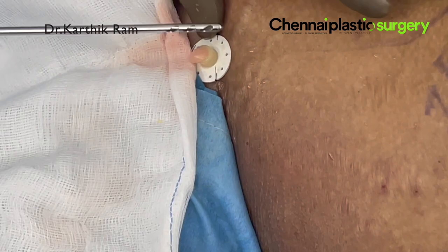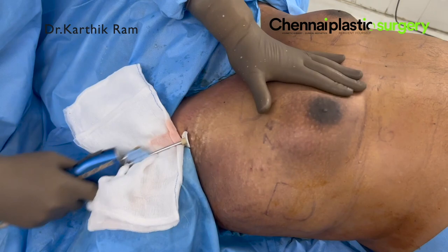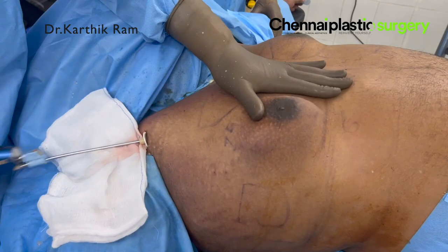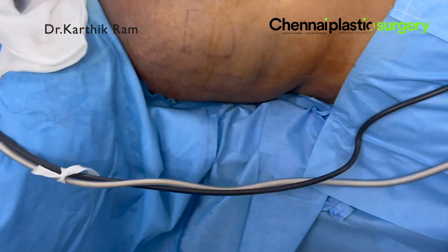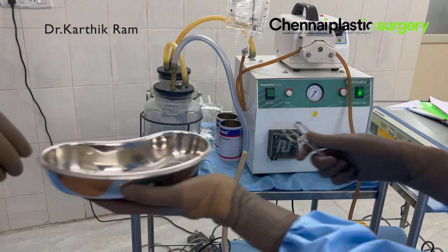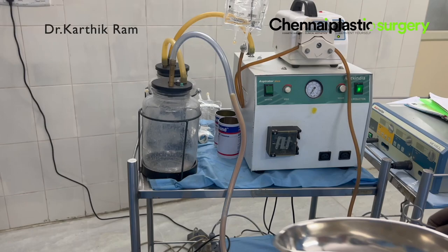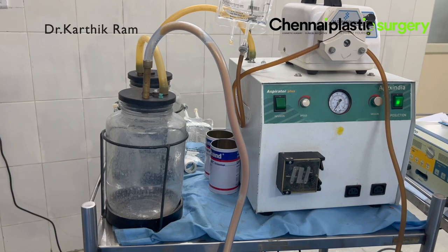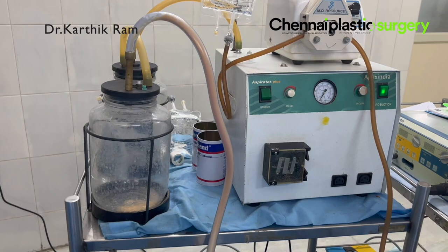Now we are starting our liposuction using the micro-air — it is a 4 mm power-assisted cannula. I am just keeping the hand; I am not giving pressure. I want only deep fat liposuction in the medial area — medial means inside the areola region — because blood supply comes from that region. I only want to do deeper liposuction there. You can see clear fat flowing through the tubes and going into the container jar. That is a 3.5 liter bottle — in some bigger cases, even 3.5 liters will come from the gynecomastia alone.